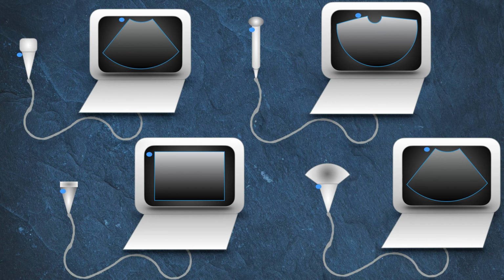The bottom left is the linear transducer, which is used for many superficial structures and procedures. As mentioned previously, depending upon the depth of the structure, you may need it for abdominal imaging as well. Finally, the bottom right is the curvilinear transducer. It has the largest surface area of any of the transducers you will use, and it is primarily for abdominal structures, however, can also be used for thoracic imaging.